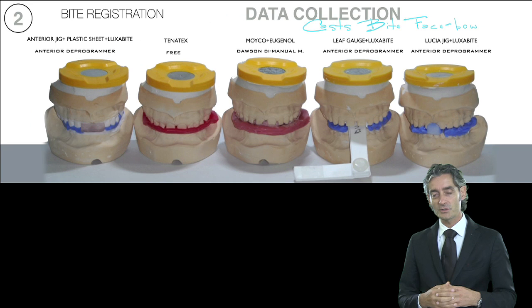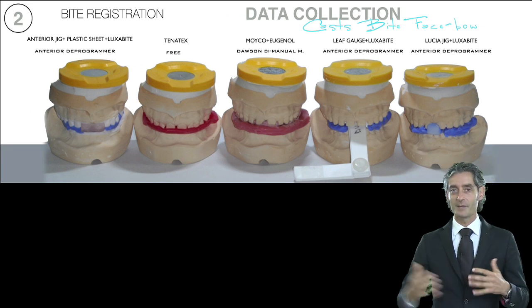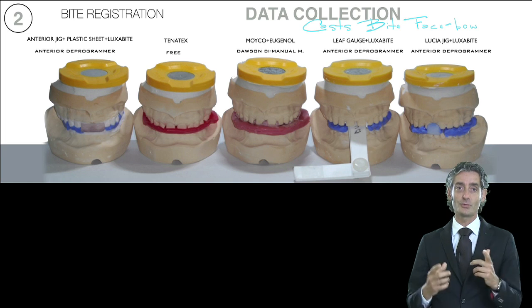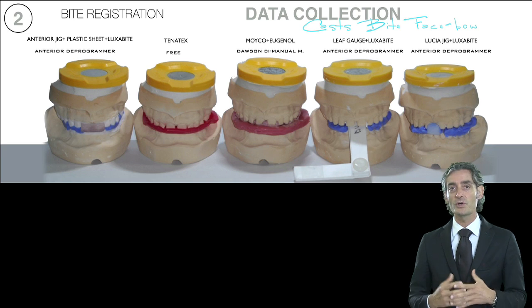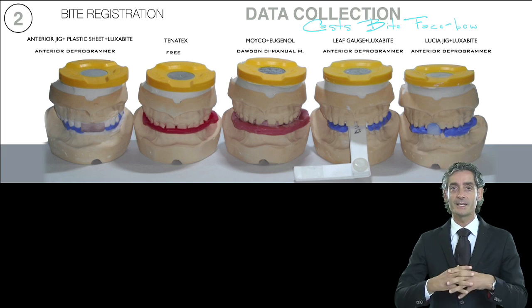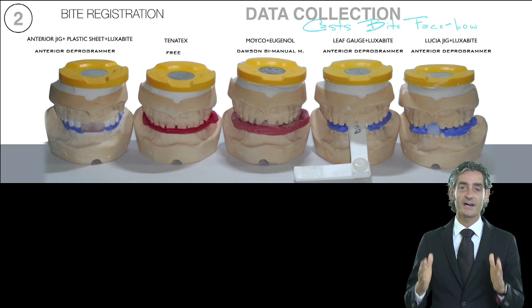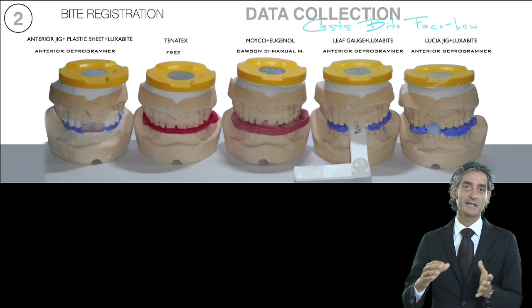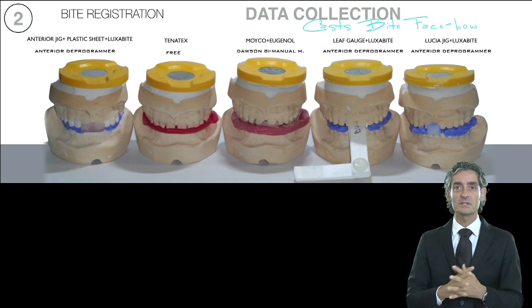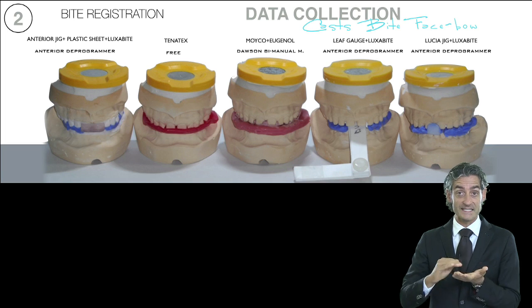And then when we start to speak about bite registration, everyone has an idea of how to create a perfect bite registration. First of all, we have to understand that if we have to do a single molar in the lower jaw, for example, and the occlusion is stable, the technician doesn't need any kind of bite registration. It's much better to have a clean and precise cast, and then it will be used to find the occlusion through the evaluation of the facets.